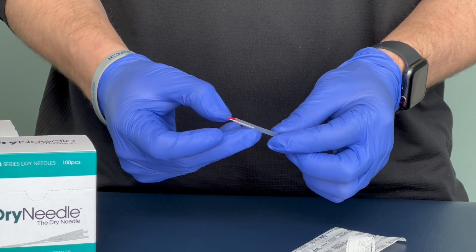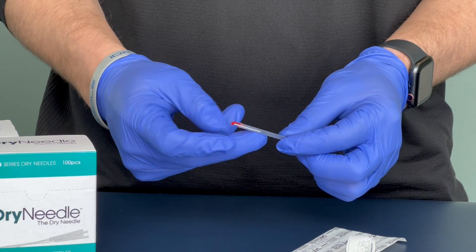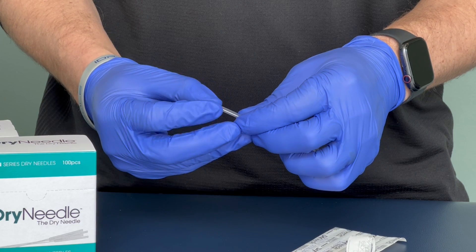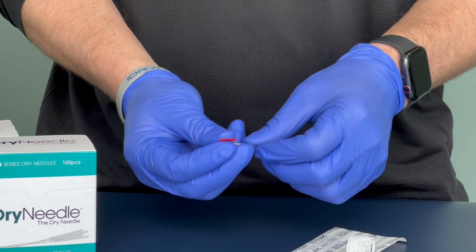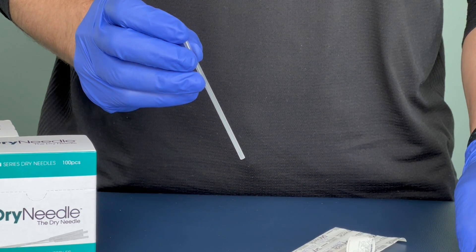What I would not recommend is trying to grab the shim itself and remove it. What I would recommend is grasping with a pincer squeeze both the top of the handle and the shim, doing a lift. Once the shim is removed, the needle is ready for use.